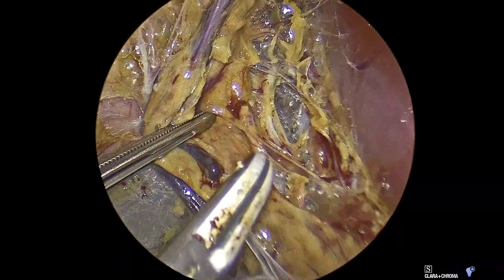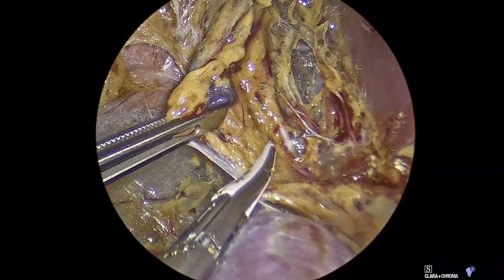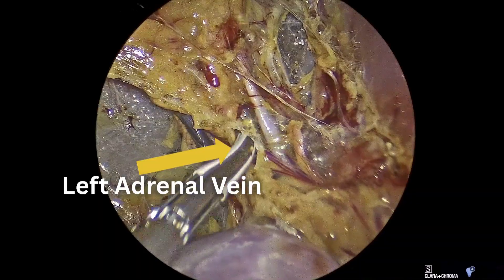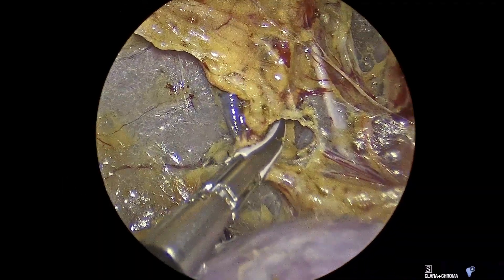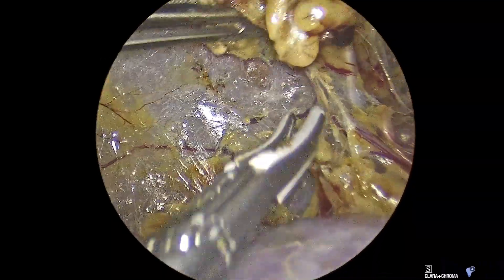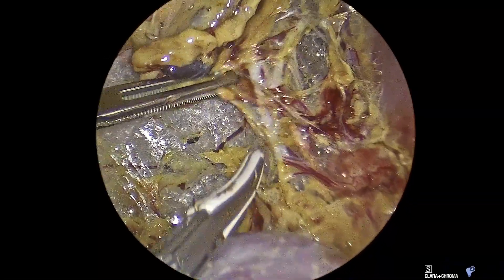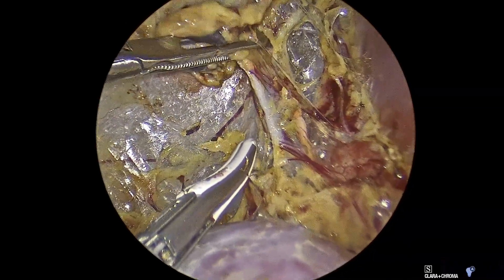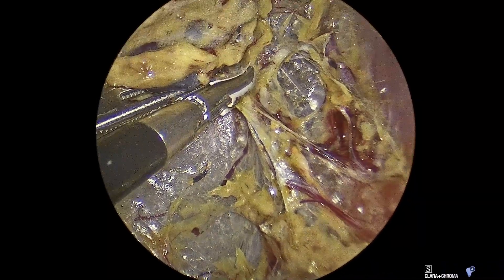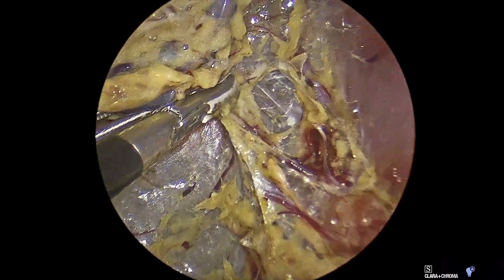Here I'm starting the dissection of the left adrenal vein. Occasionally, with bigger tumors, we put a clip on the vein, but in many cases it's ligated just using the ligature device. Here I'm using my grasper to grab the adrenal vein — we don't want to grab the adrenal tissue, but the vein is good to grab. And here I'm ligating the left adrenal vein, and then it is divided.